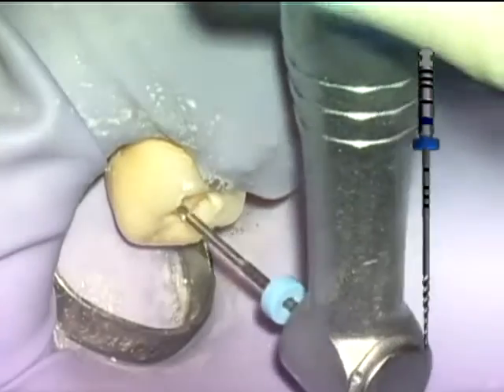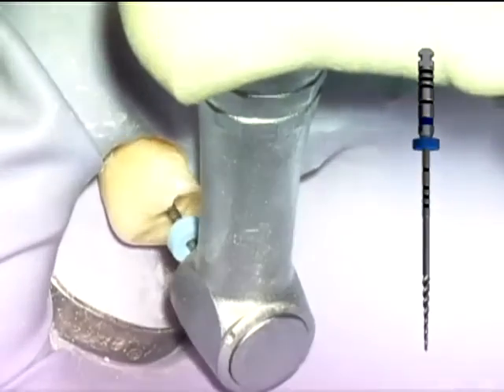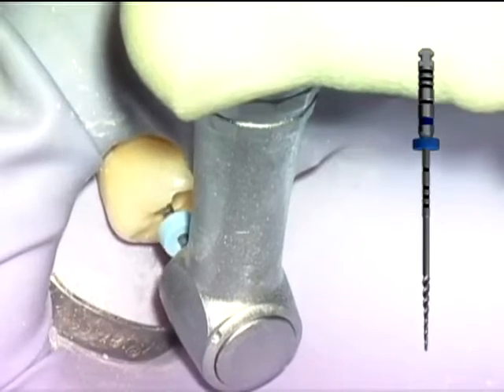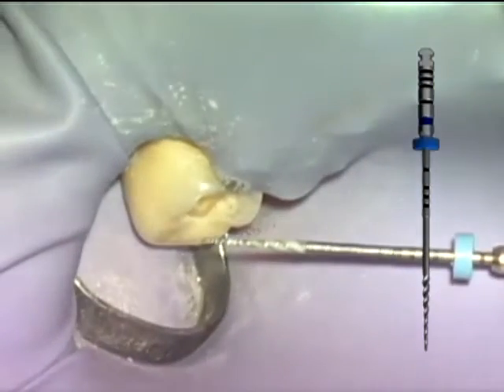Because this is a medium-sized canal, at least an 08 taper is needed for final shape, so the next GTX file size is the 3008. This file quickly cuts to length, and again we see no debris in its tip flutes, indicating the need for a 40 series file.